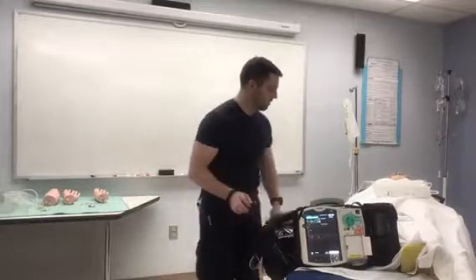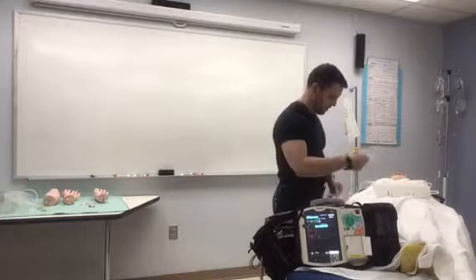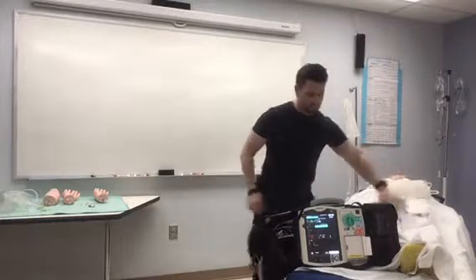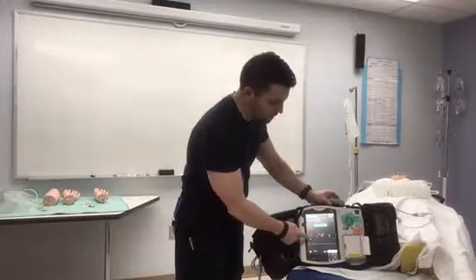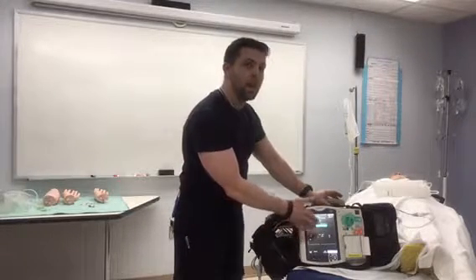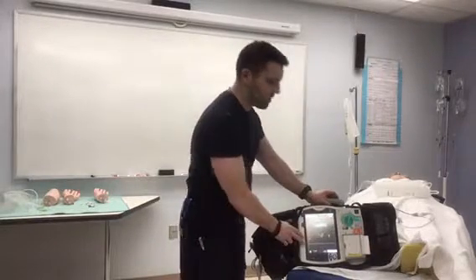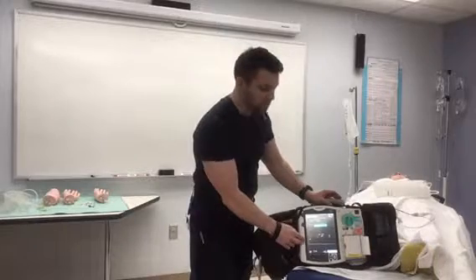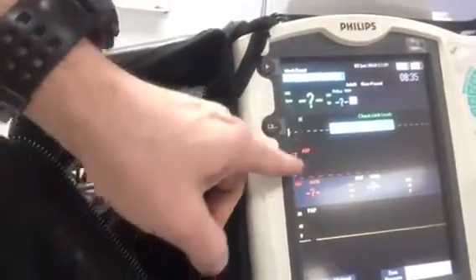The other line, if we disconnect, is now the bottom yellow line, and it's got a pressure of 0 to 20, PAP for the pulmonary artery pressure. So this can give us our pulmonary artery waveform, as well as if we go to inflate our bulb, we can get a wedge off of this as well. But the thing to notice about the difference here is that it's 0 to 20 versus 0 to 150. All right, so I'm going to bring that in, let you guys see that. All right, so 0 to 20 versus 0 to 150.